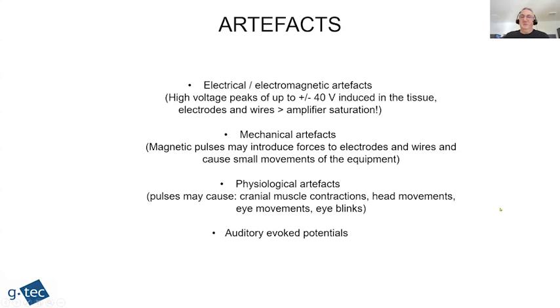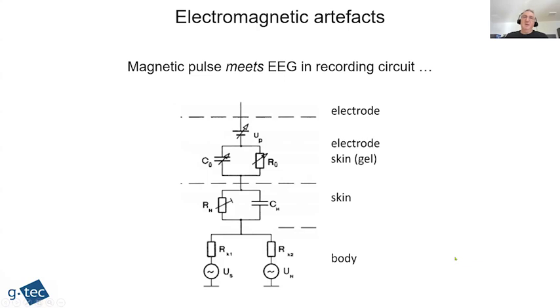Then there's a number of different physiological artifacts, including the eye blinks. Also, the experiment takes some time, so there are some head movements, etc. And there is the auditory evoked potentials caused by this click sound or tick sound when the TMS device discharges. There is also an additional artifact that is not presented here, that is the recharging artifact, but it is easily avoided when you set the recharge to a longer time than your time window.